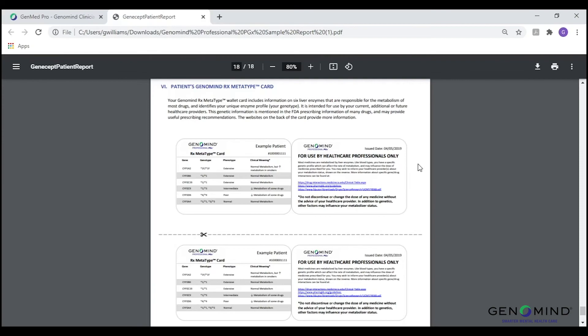Last but not least, the final page of our report includes the patient's Genomind Rx Metatype card. This wallet card includes information on six CYP450 enzymes that are responsible for the metabolism of medications and identifies a patient's specific genotype and activity profile. The Metatype card serves as a wonderful resource to be shared by patients with other prescribing healthcare providers.